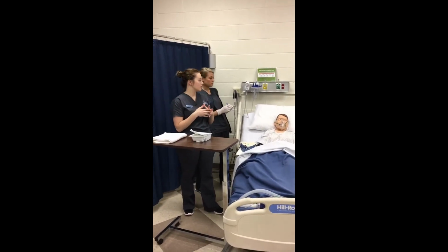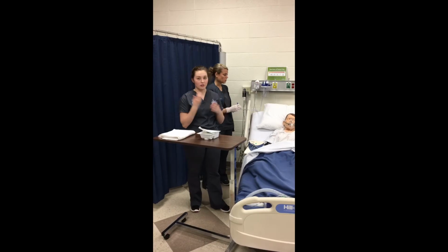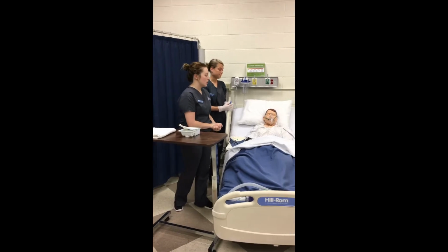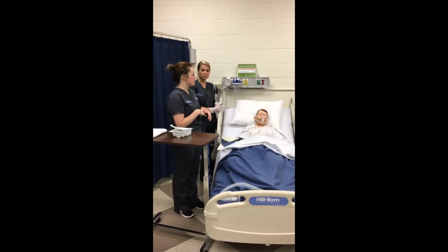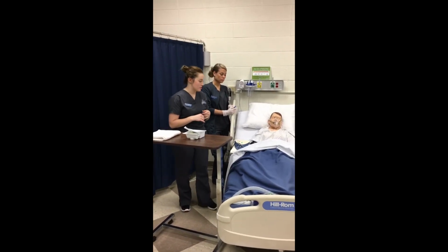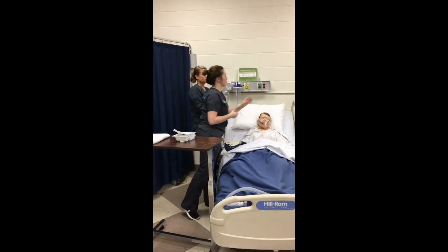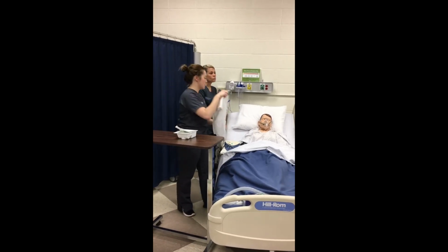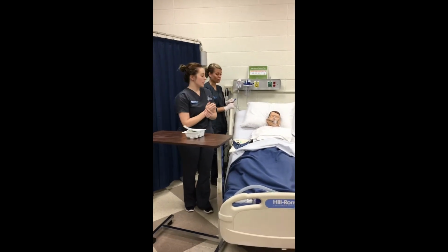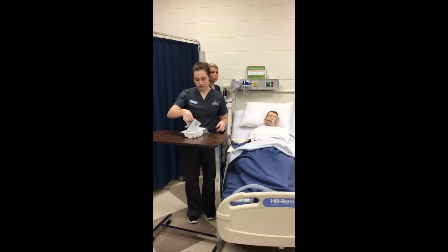At this time, I can apply any gowns, masks, goggles, anything to decrease the amount of secretions on my person. I will also want to position my patient in a semi-Fowler's position to increase the comfort for them. I'll then want to hyperoxygenate and place a towel on their chest. After all that, I am going to set up my sterile field, removing my gloves.